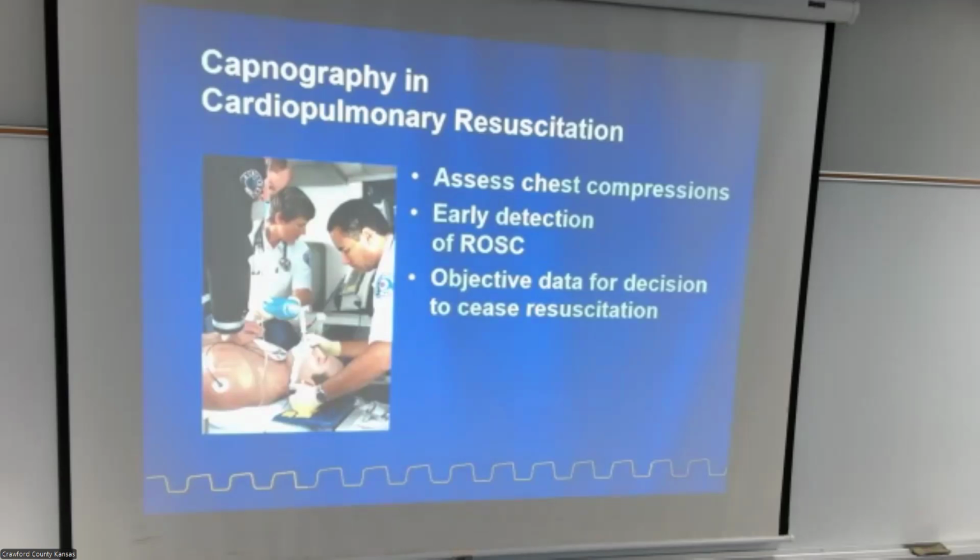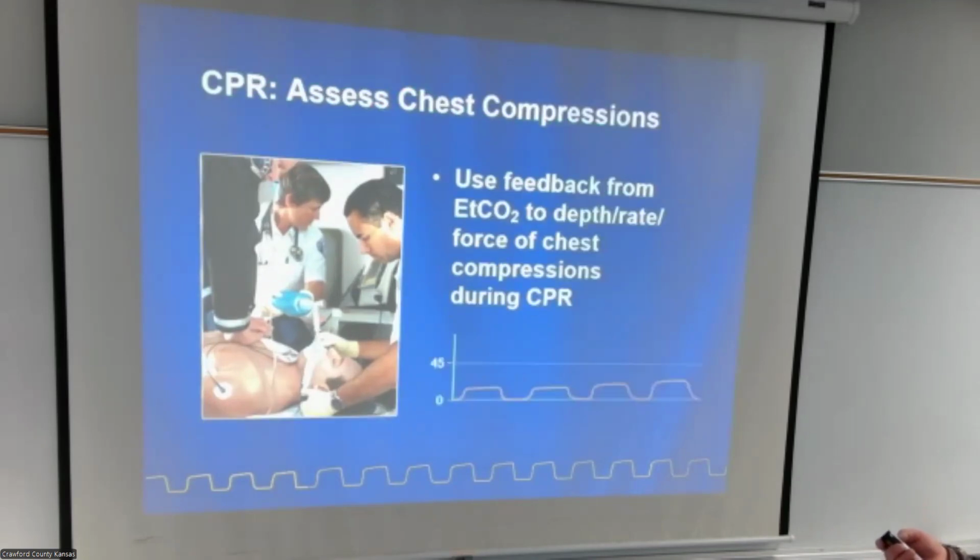It's great for assessing chest compressions and early detection of ROSC. Like I said, as soon as you get a spike in numbers, stop CPR. Because if you listen with a stethoscope to the heart, it may be faint, whatever. But if you get an increase in CO2, you have a heartbeat. Without it, you would not have a CO2. You can always use the feedback on CO2 and depth and rate for chest compressions.